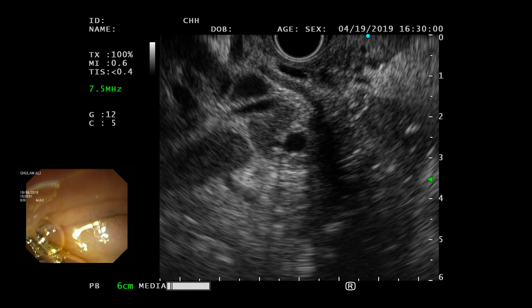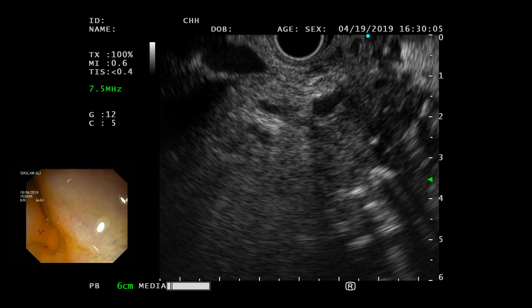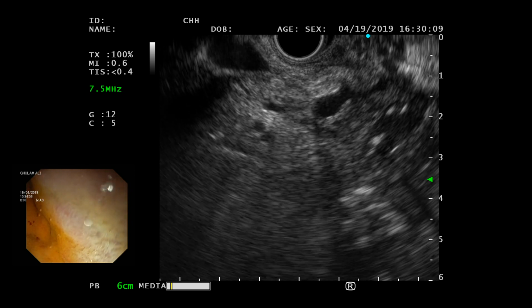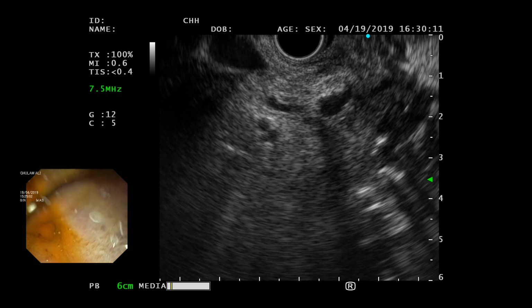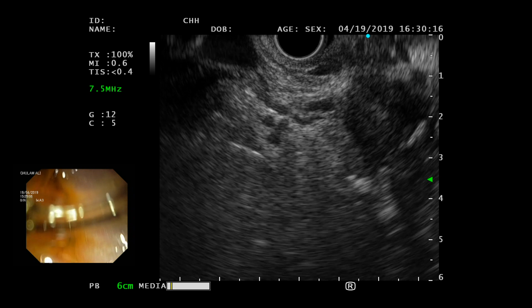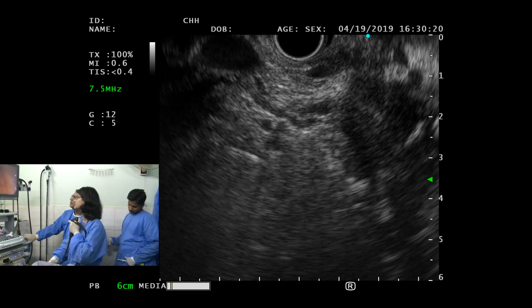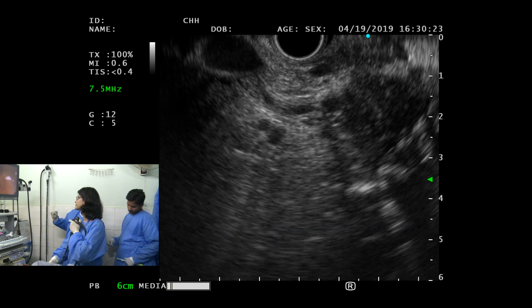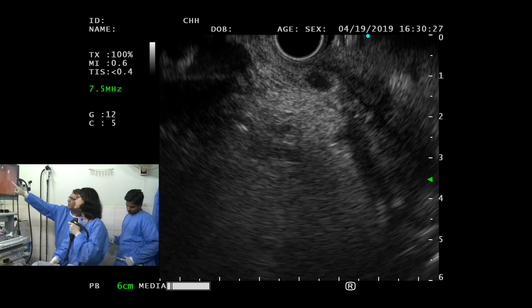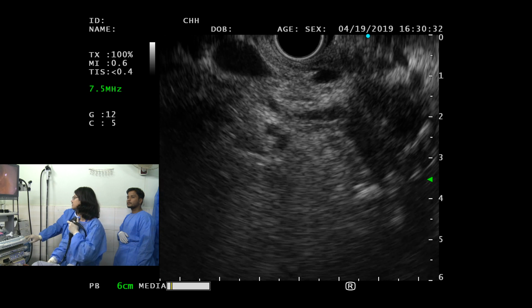Yeah. Was the tissue going in there, or was it necrosis? Okay, now it has gone. I think so, it happened easily. Okay. Yeah. So where is the opening of the duodenum? I mean the duodenal apex. You have to see that, because if you push without seeing it, you will reach the peritoneum, on the side. Okay? Where? At 12-11 o'clock. I'm not sure. I think it is there, but what is this? Shouldn't be like that, right?